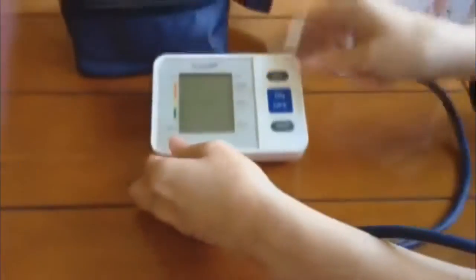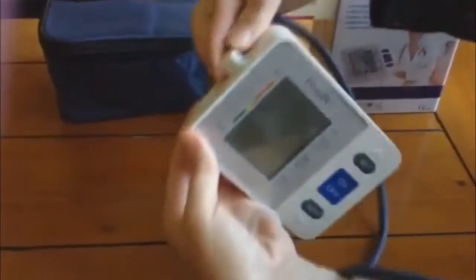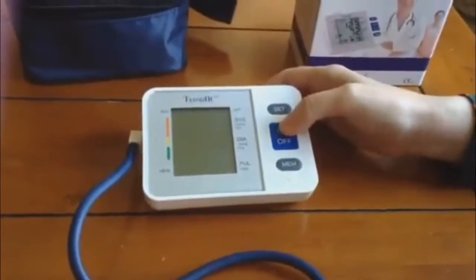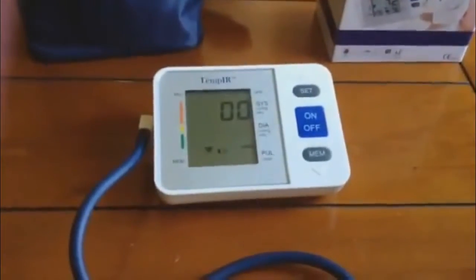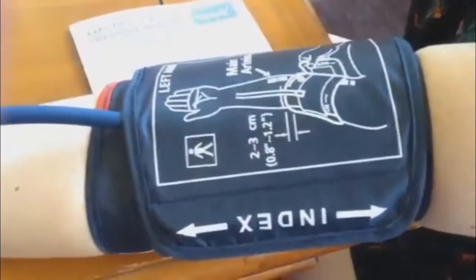So, let's get started. Please keep quiet and maintain the cuff and heart at the same height.